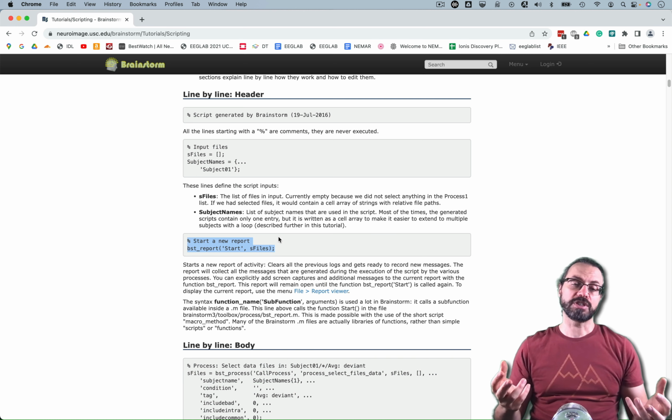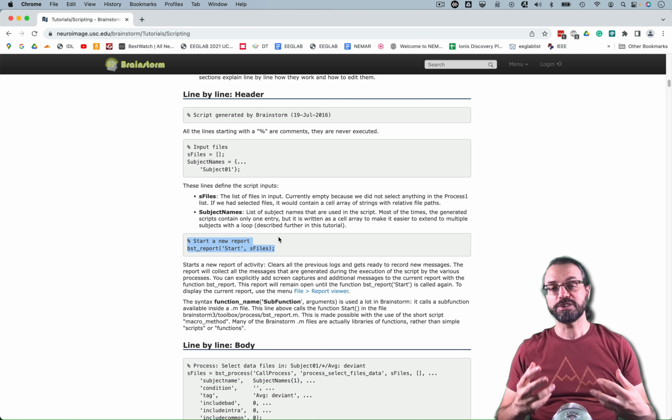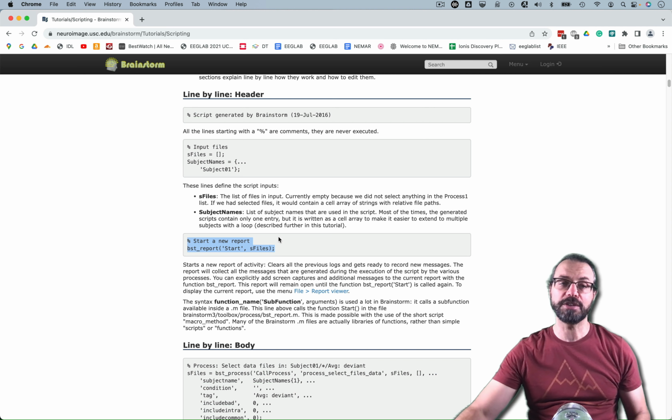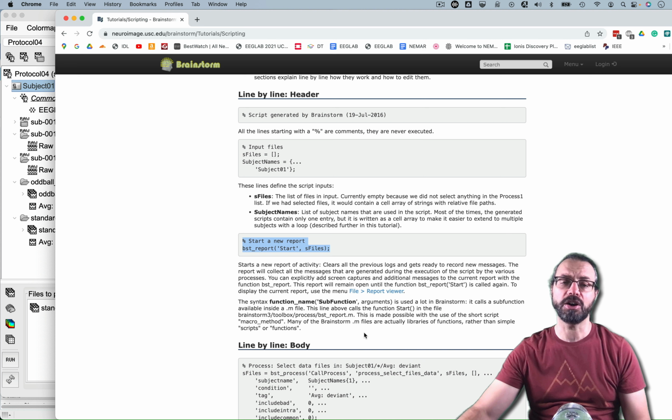And luckily the functions are very well built and very structured. So if you want to do that, it is possible. But it's not easy, and you need to be a programmer to go to that level of detail. So if you want to do an advanced pipeline, you really have to dig hard.